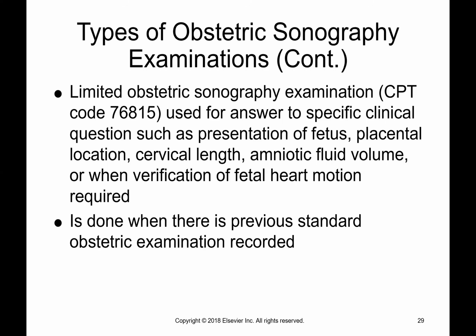A limited exam is a 76815. That's the code, which you don't need to know at this time. But that's just when a doctor wants to look at a specific thing. He thinks that the placenta might be in a lower location than it should be. Then he would say limited ultrasound for placental location. And we will just look at that, and we won't do a full anatomy screen.